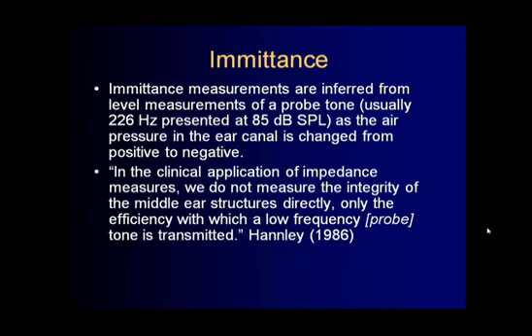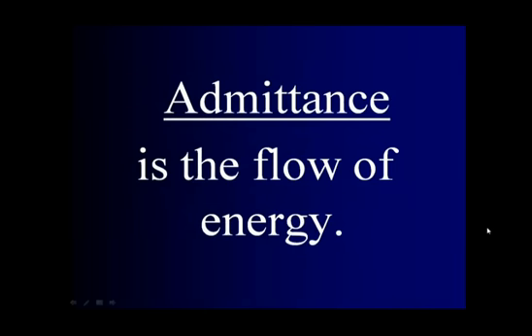In the clinical application of impedance measures, we do not measure the integrity of the middle ear structures directly, only the efficiency with which a low-frequency probe tone is transmitted. Don't forget, admittance is the flow of energy. It's actually the flow of sound energy into the middle ear.